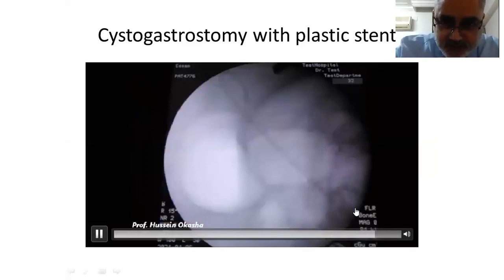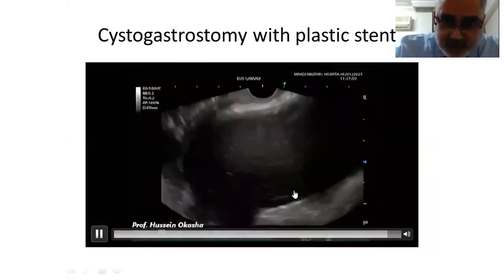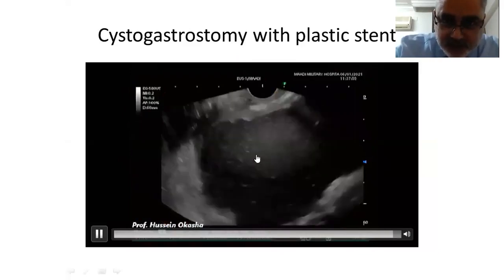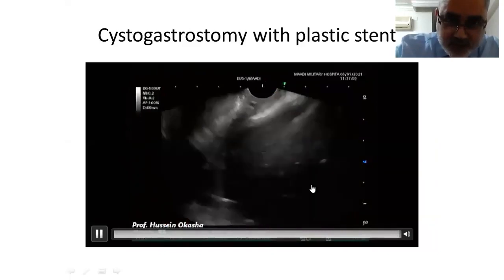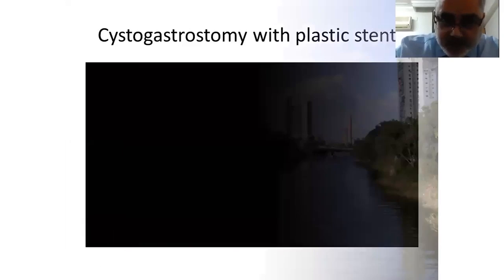And here, this is the fluoroscopic view. This is very nice. This is the cyst, and here this is inside the stomach, and this is inside the cyst, and this is the cyst decreasing in size, and the amount of fluid shifted from the cyst to the stomach. So there is gradual drainage of the cyst inside the gastric cavity. And thanks for your attention.